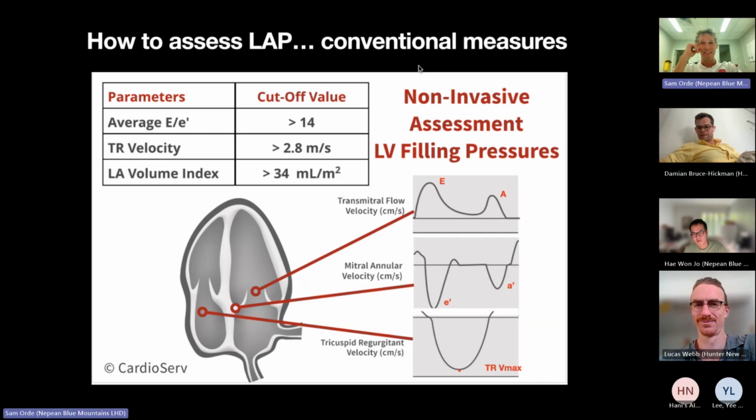I think we look at gradients, and the gradients did go up in this lady, but I could probably talk the whole hour about that lady, to be honest. I use lung ultrasound as well to make sure that we weren't overloading her backwards, and I think you've got to balance it out, because this fluid doesn't stay in her system indefinitely, right? It's also going to become leaky with the sepsis and the glycocalyx dysfunction.